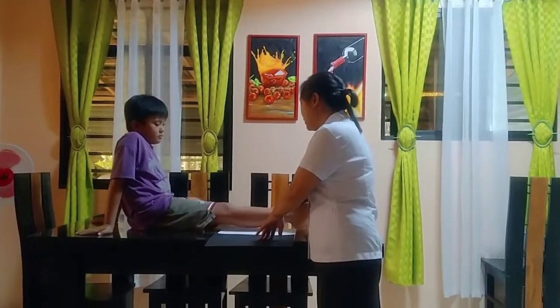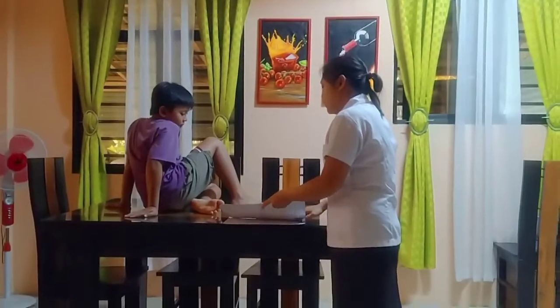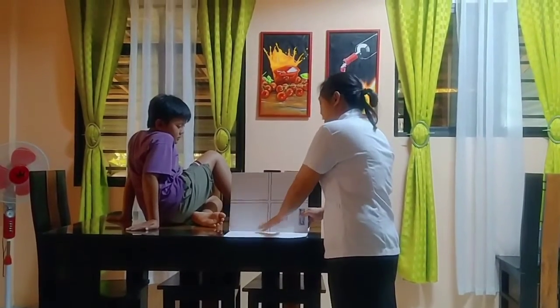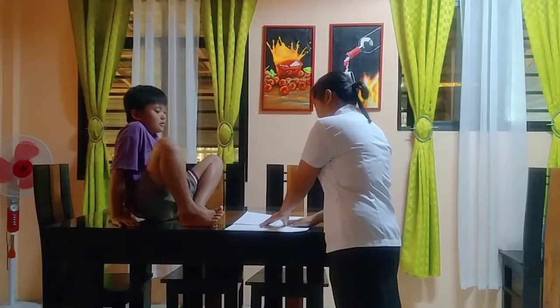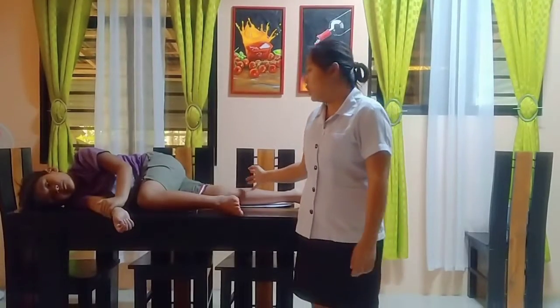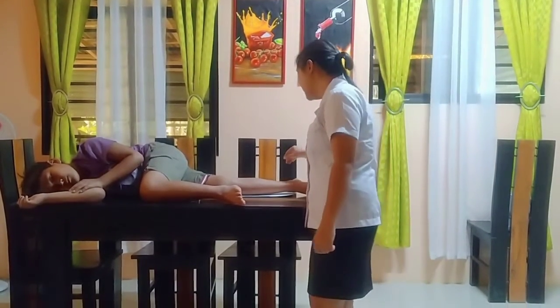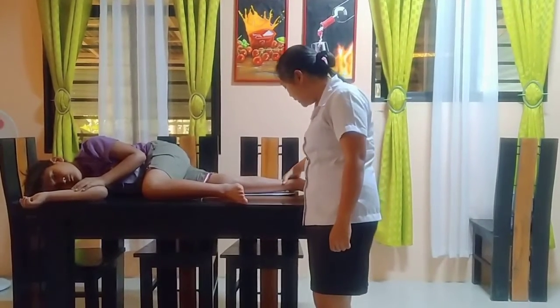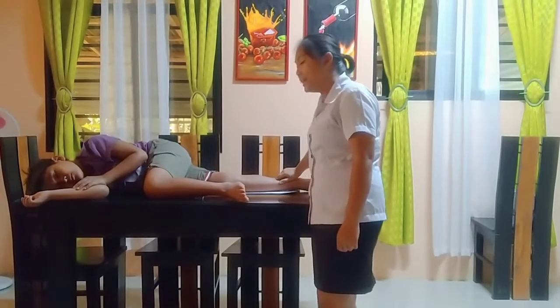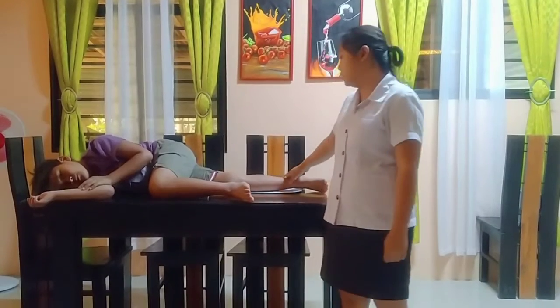Next, remove po muna natin yung paa ng pasyente. Now, we will flip the leg. Ayan po. Lie towards the affected side. So, ensure that the malleolus is included. Ayan po. Slightly flex the knee of the patient. Ayan.